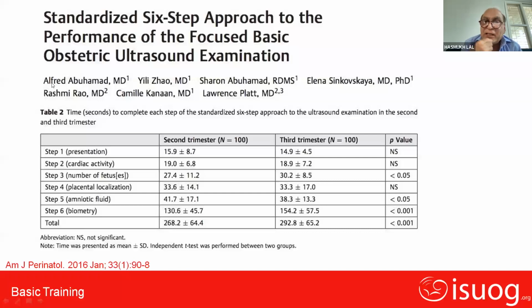So what I would like to emphasize is that if we follow a standardized 6-step approach to start with, then we will have economy of movement. We don't have to randomly rotate the transducer here and there, because this is a very standard protocol, and we have observed by watching a lot of sonographers worldwide that they are also able to do these things very efficiently. So in the ebook, all 6 steps are written. Those of my friends who have received the ebook can look again. So I think this is what I would like to say.